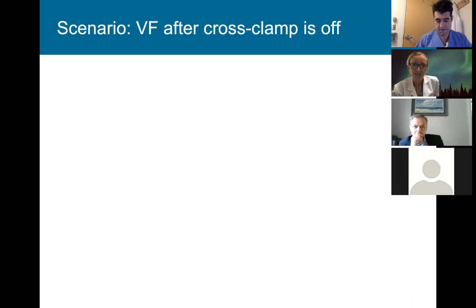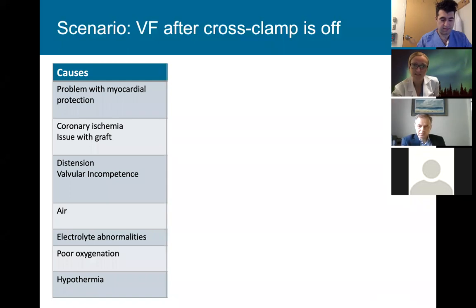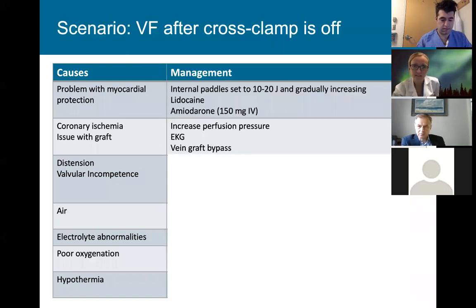Well, it's important to know what the initial operation is, but it's my understanding that it's not completely uncommon to have some ventricular fibrillation right after the clamp comes off from reperfusion. You can defibrillate the heart and see if you regain normal rhythm. And then again, if it's a CABG, then you need to consider other differential diagnoses that you have there. Great.